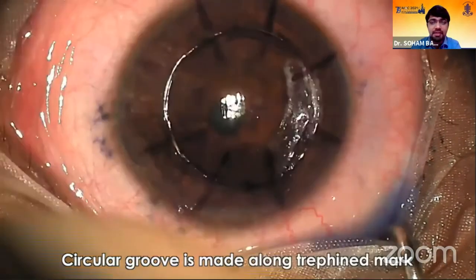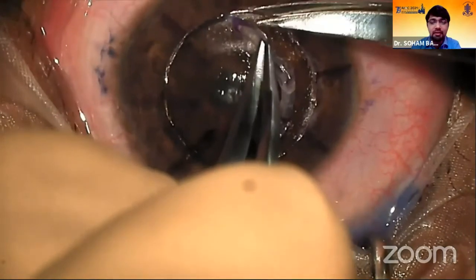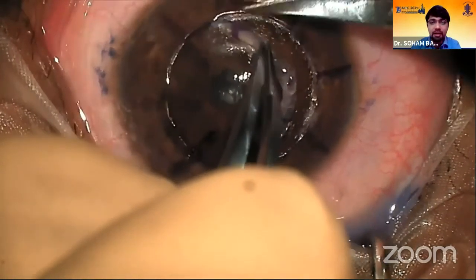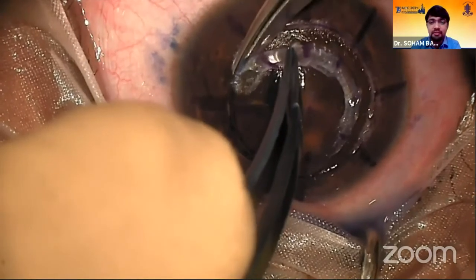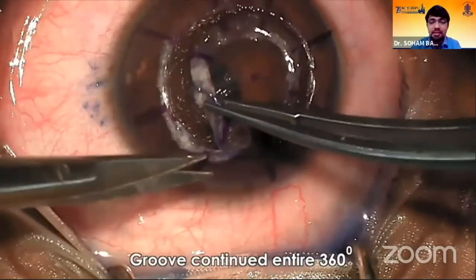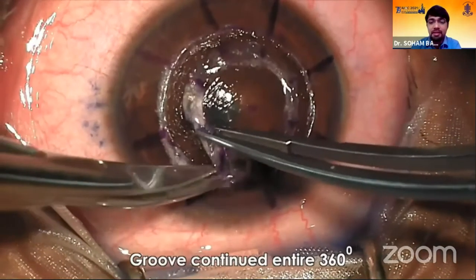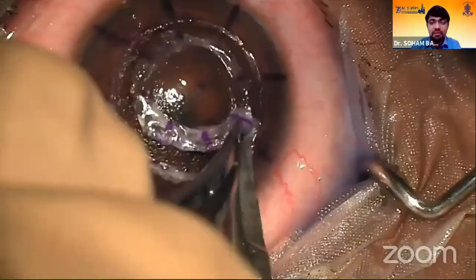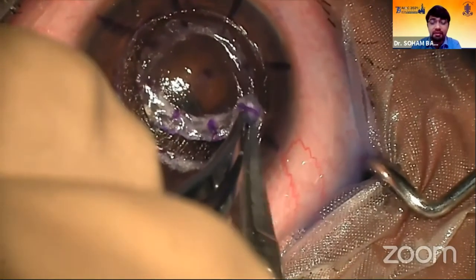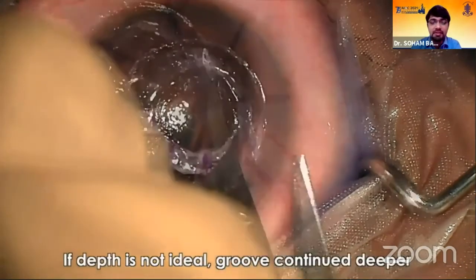So the safety of this technique is this. You're not at all going anywhere near the thinner parts of the cornea, and everything is essentially a blunt dissection. And the beauty again is here you're not entering the AC. So this is just a completely extraocular procedure. So in terms of the intraocular infection part of it, that safety is maintained.